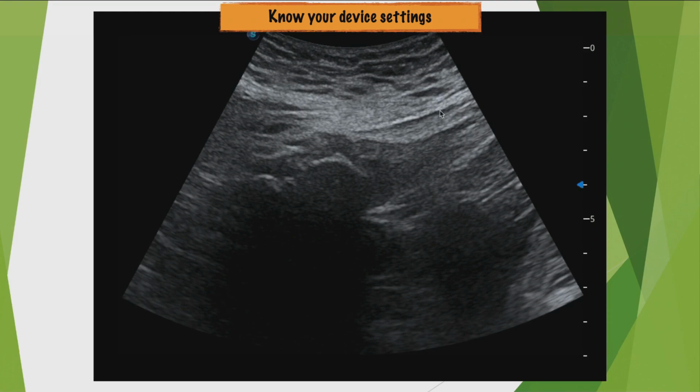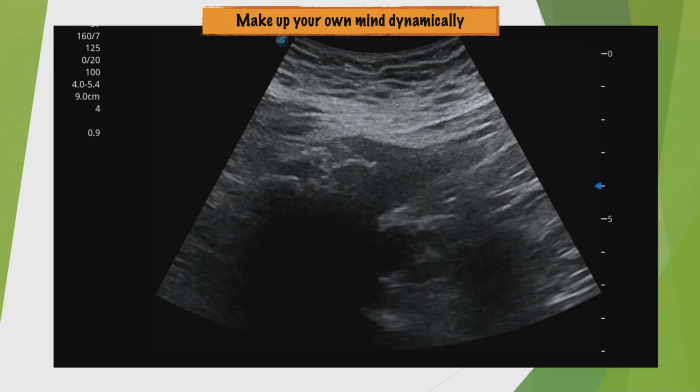As you can see, we're starting to see much better. Here, our conjoined tendon, we can clearly see the loss at about this level of the fibrillar aspect, which will be replaced by an anechogenic zone. We're getting a better look at the irregularity here of our ischium, with here again a small hyperechogenic image. So you can see that by improving image quality, you gain additional information.